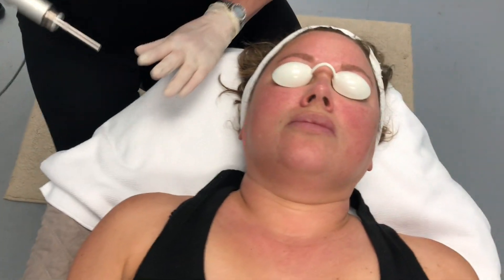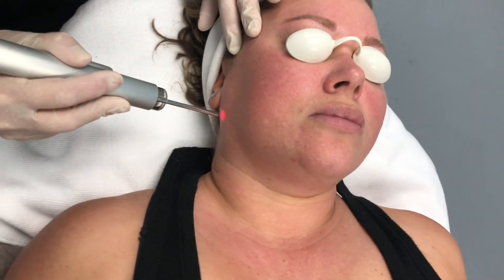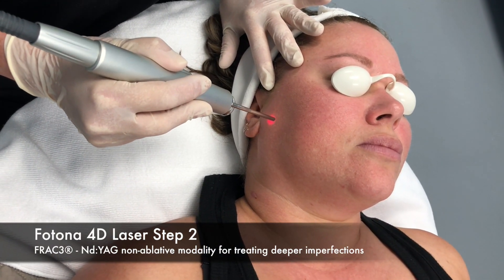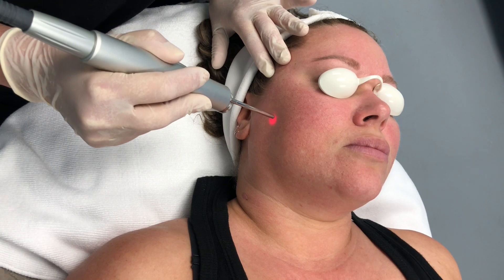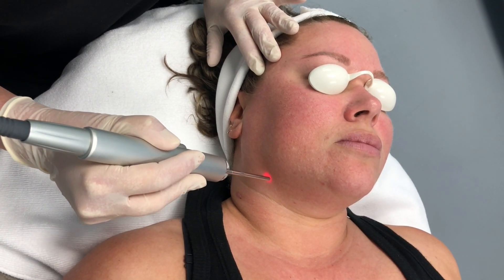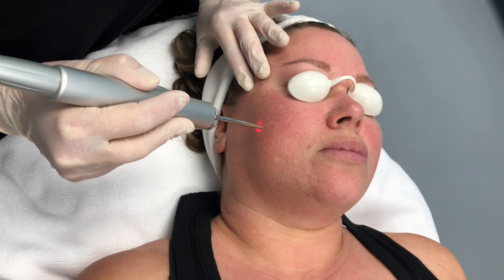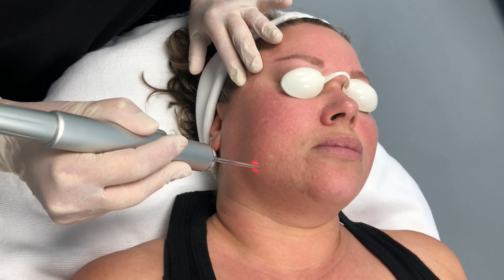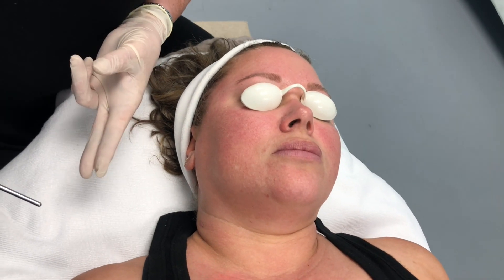I have the 9mm on now, but normally what I do — just to speed up the video — I do two passes of the 4mm on just the face, and then one pass of the 9mm all over the chest, neck, and face. The 9mm is great for all-over anti-aging. The 4mm is going to be more concentrated, going deeper into the skin, breaking up brown pigment so your body can digest it more easily, and also doing deep tissue collagen remodeling. The 9mm provides a really nice, more gentle all-over anti-aging effect. Two passes with the 4mm, then one pass over chest, neck, and face with the 9mm.